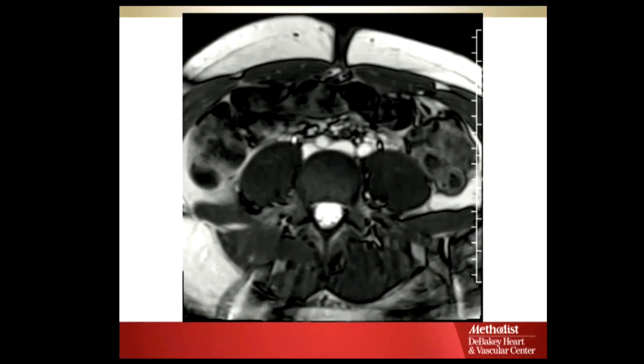So we do a lot of dynamic MRs. Also the nutcracker patient that I saw, median arcuate ligament, all these compression symptoms. We actually do a dynamic MR, and it really gives you real time what's happening. You can see the compression in real time, and that makes you more comfortable that we have the diagnosis.